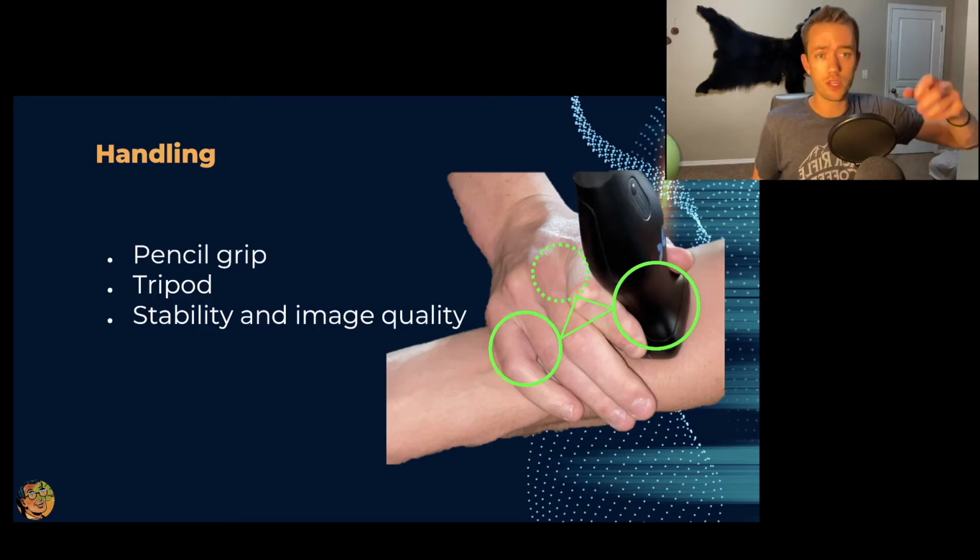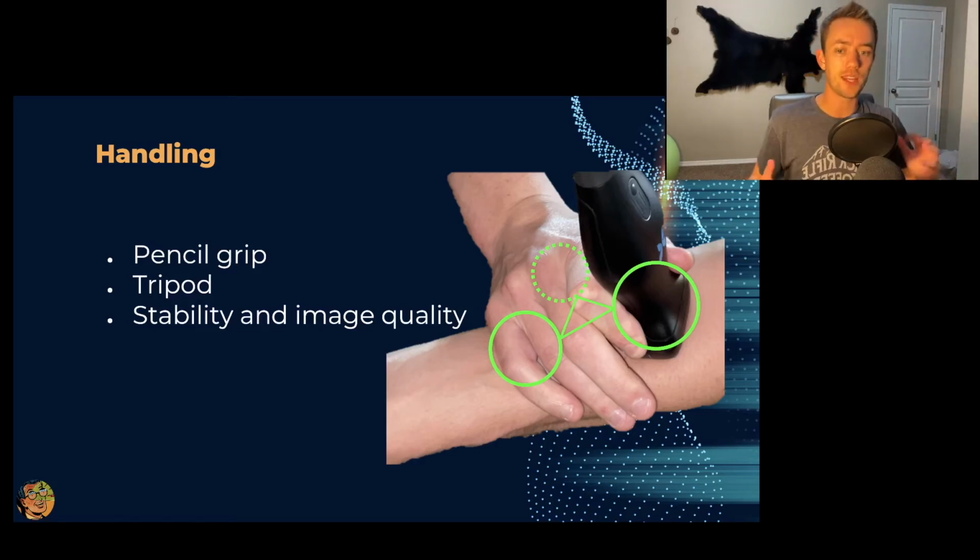Like, you put that on a patient, you can turn and look at the probe. It doesn't matter how much gel you have on there. That thing's not going anywhere. And stability is going to increase image quality, and it's going to decrease the amount of time that you have that probe on the patient. It's going to greatly increase how well you do with obtaining scans.